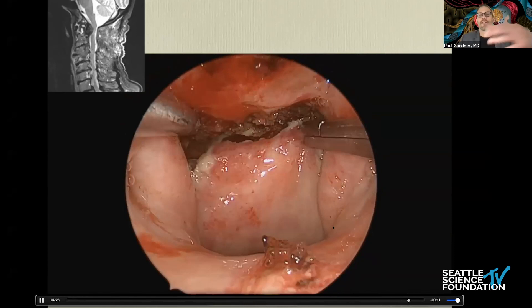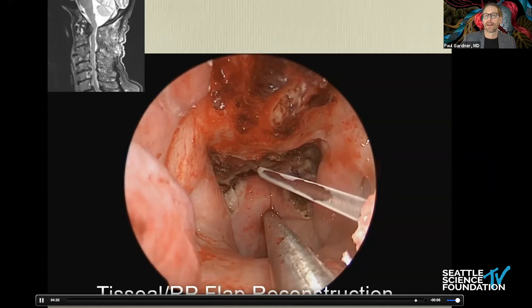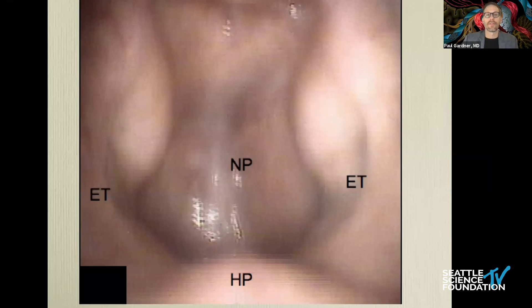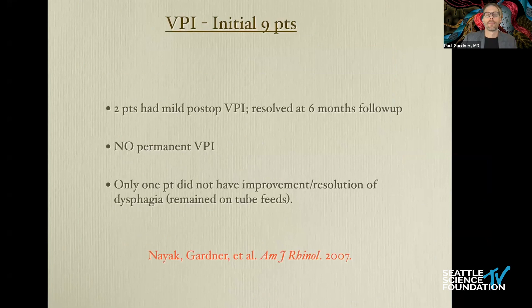Here we're elevating the rhinopharyngeal flap and placing tissue sealant to hold it into place. The immediate post-op shows a beautiful decompression. This has a very clear advantage over a transoral approach — these patients can be fed immediately and we can avoid issues such as velopalatal insufficiency. When we study this, it simply is not an issue.